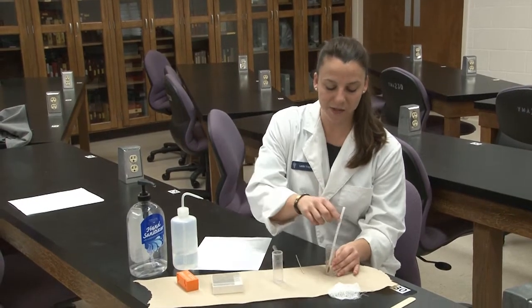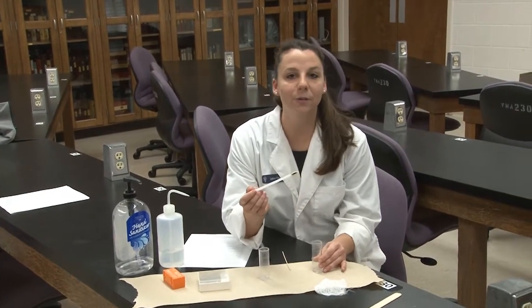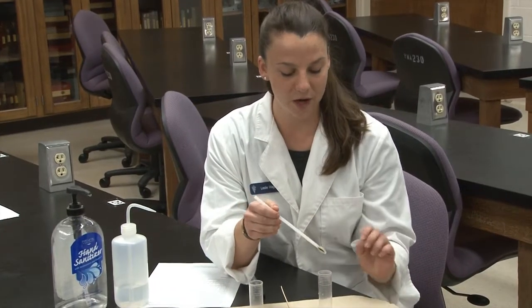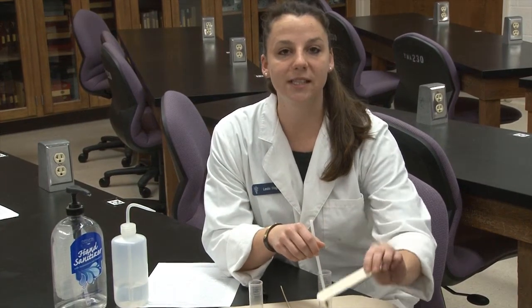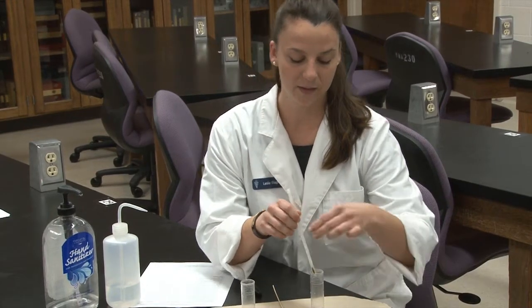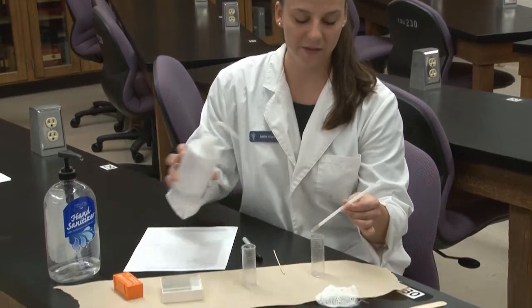To begin with, you'll have a fecal sample. Here I have a pre-collected one from a dog, but if you have a ruminant species or just a sample in front of you, you'll use a tongue depressor to select about a quarter of a teaspoon of sample and place it into your vial.